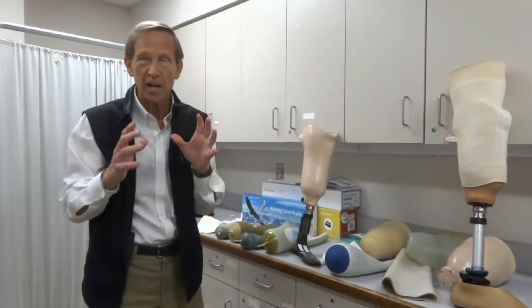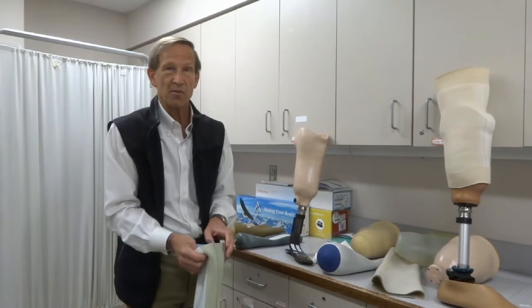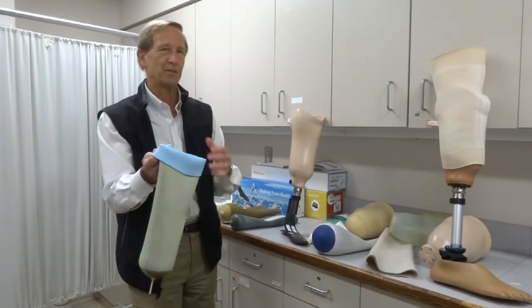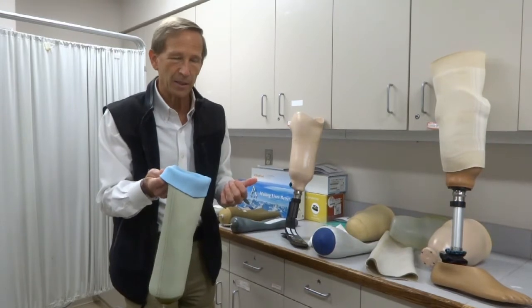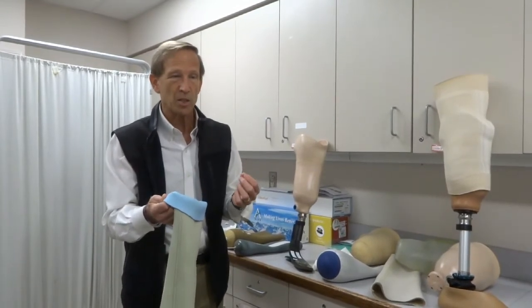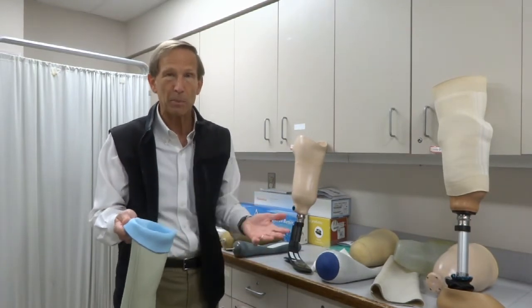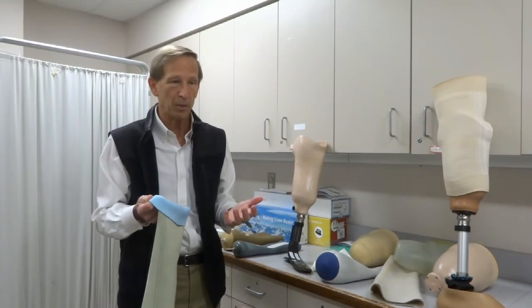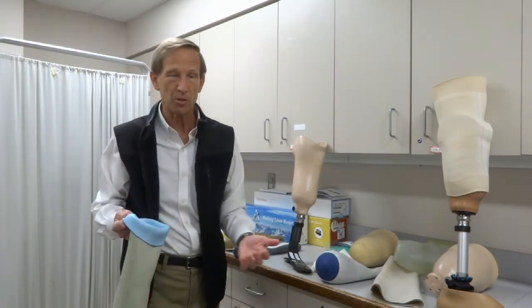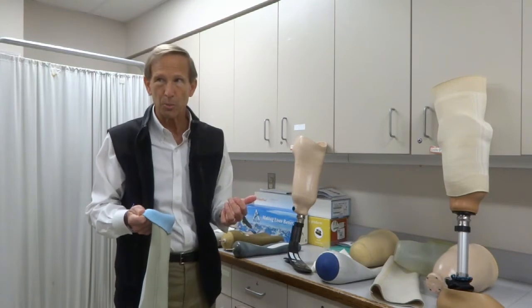Last but not least, let's talk about hygiene and skin issues. Because you're putting these gels directly against your skin and you're trapped inside there for eight, ten, or twelve hours a day, everyone gets a little bit sweaty on a hot humid day. Some gels have a special construction to try to cool your leg down, which helps a little bit. Sometimes you have to take the leg off in the middle of the day, wipe off, dry your leg, wipe out the gel liner, and then put it back on. If you consistently have problems with perspiration, there are antiperspirants you can put on your skin the night before — CertainDry and DrySol are two examples. Talk to your physician about skin hygiene or perspiration problems.